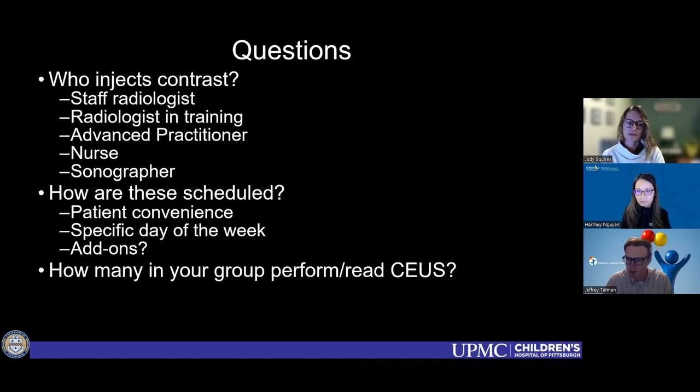They can always ask one of us that's more comfortable with interpreting the examinations if they need to, but they can at least be present and help triage the logistics of actually completing the examination. For some of the weirder indications, the more off-label stuff, those end up going to me a lot of the time. So we run into the same kind of scheduling issues just because I have to be there. But overall, if you can make it so that as many people as possible are comfortable doing these examinations, I think that's really to the benefit of making it as smooth as possible to schedule and get these exams done.